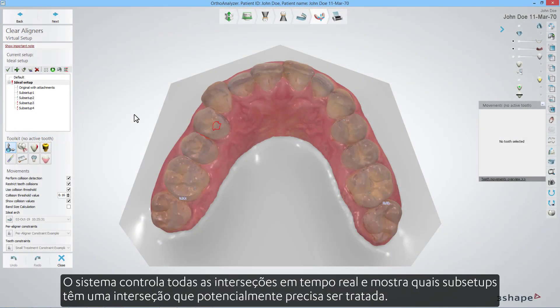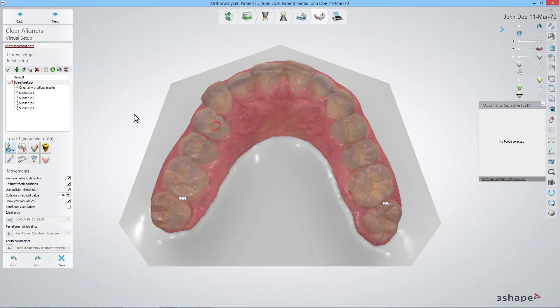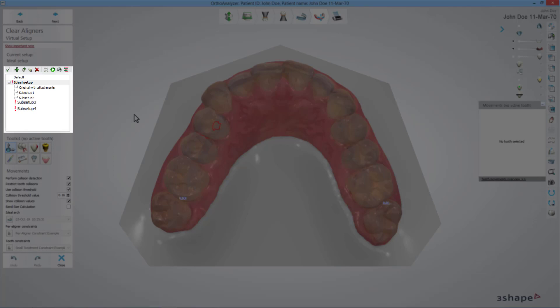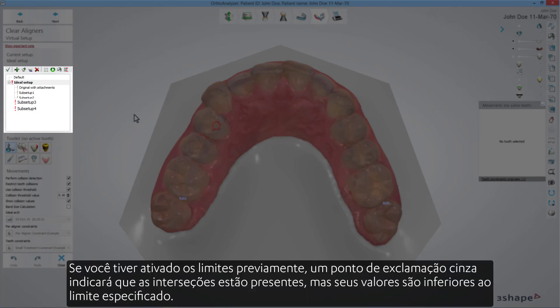The system keeps track of all intersections in real-time and will show you which sub-setups have an intersection that potentially needs to be handled. In the overview list of setups and sub-setups, a red exclamation mark is displayed next to those that have intersections. If you have activated the thresholds beforehand, a grey exclamation mark will indicate that intersections are present but their values are lower than the given threshold.